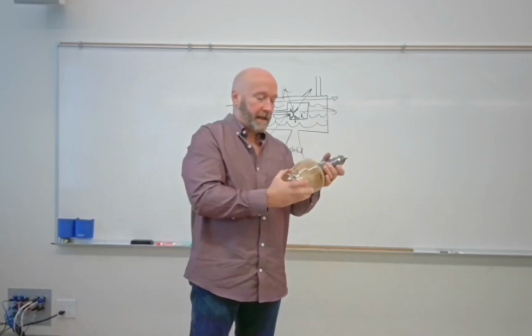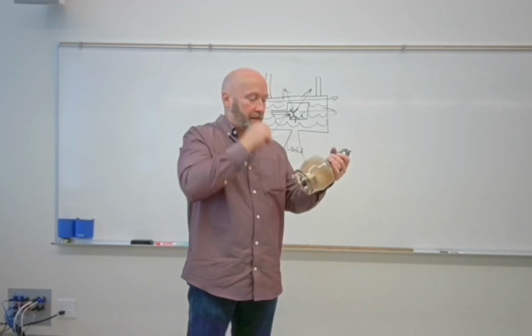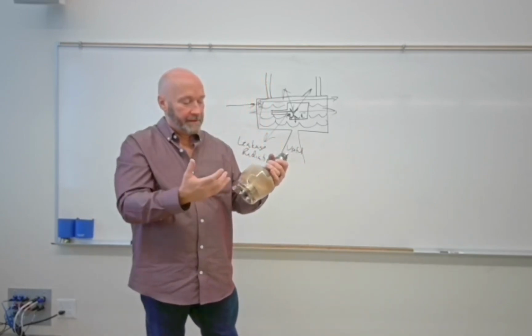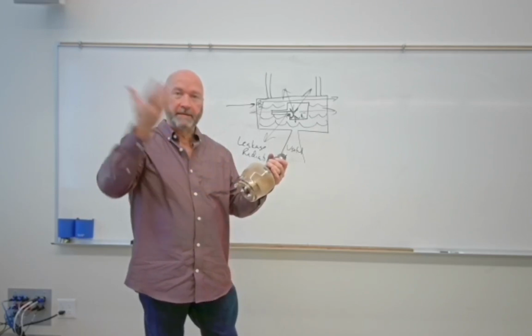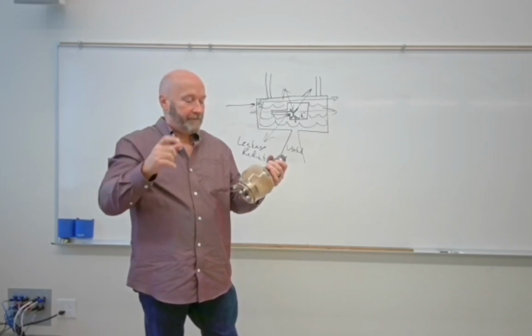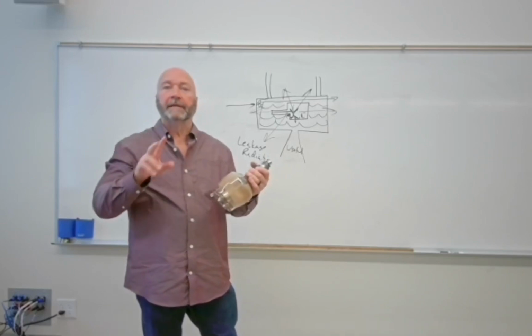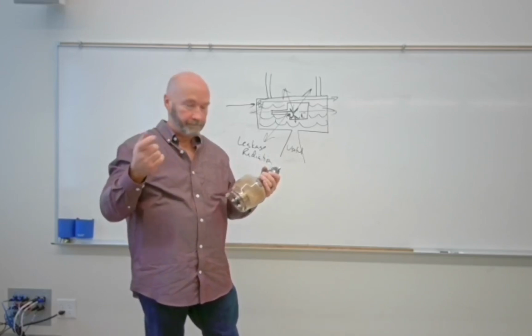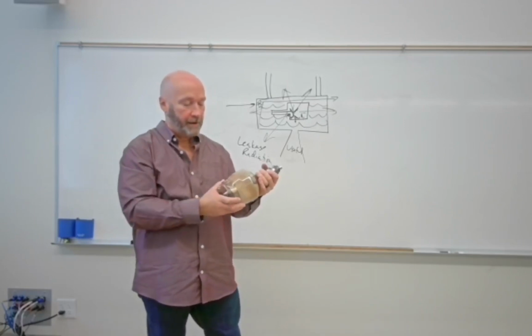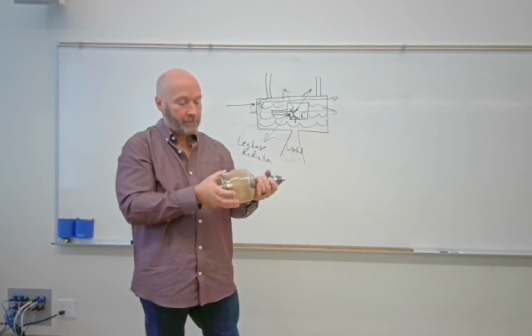Also look at the cathode, and you'll have to look at it from the opposite side of the X-ray tube. You can't really see everything that's going on, but you'll see this V-shaped thing. Inside that V-shaped thing, you've got two filaments. I'll pass a cathode around so you can see the individual filaments too. We're going to talk about that V-shaped thing as well.